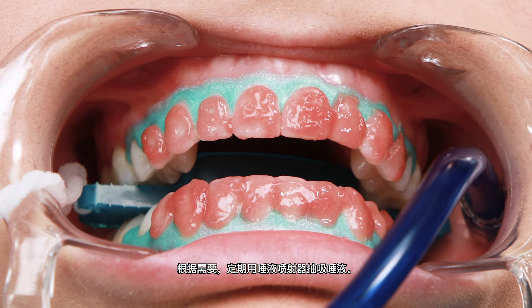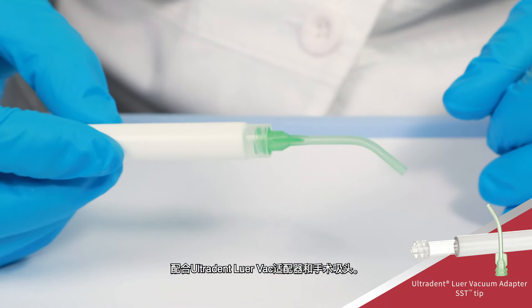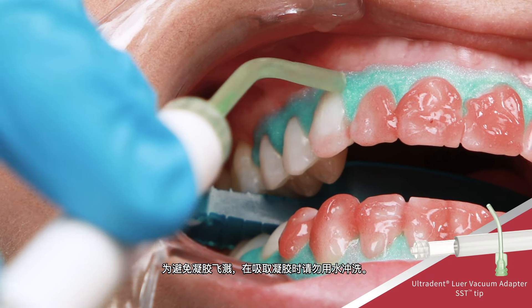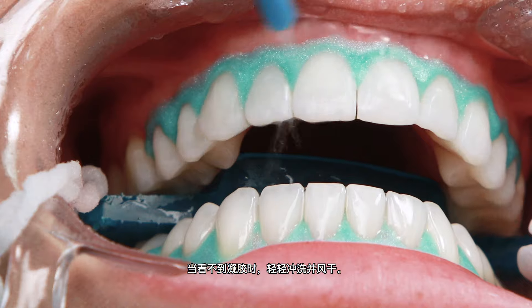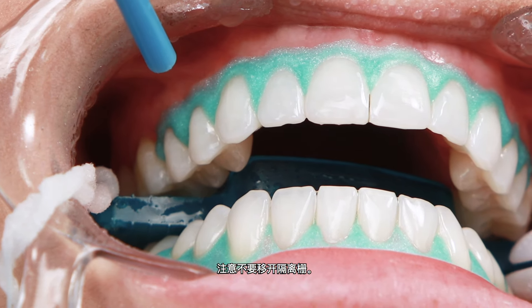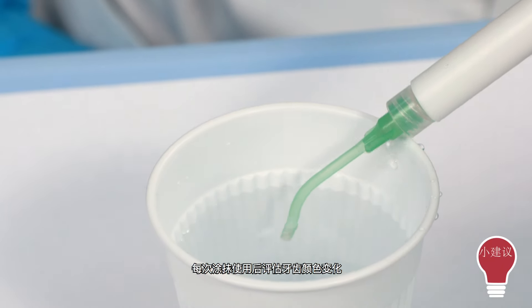Periodically suction saliva with a saliva ejector as needed. Suction gel from teeth using the Ultradent Lure Vac Adapter and Surgical Suction Tip. To avoid gel splatter, do not use water while suctioning gel. When no gel is visible, lightly rinse and air dry. Use caution not to dislodge the isolation barrier. Clear suction periodically with water.